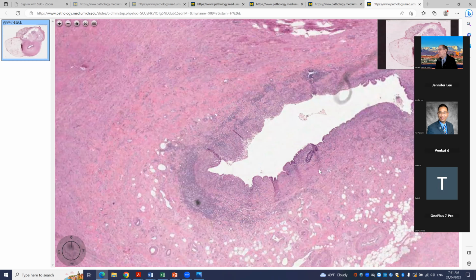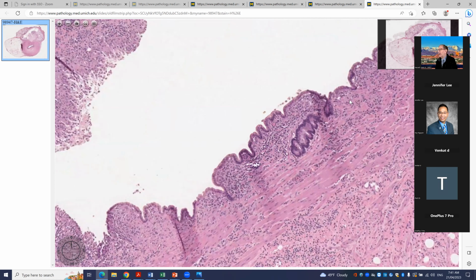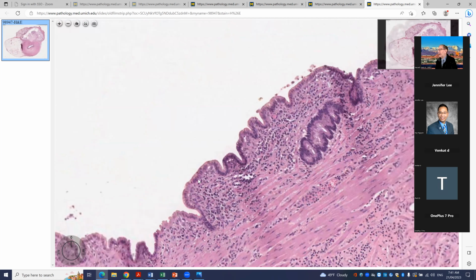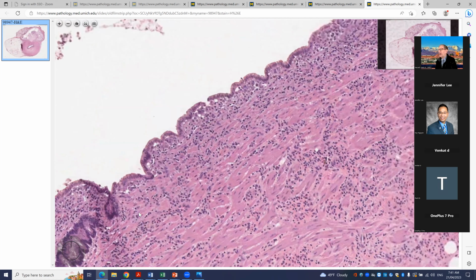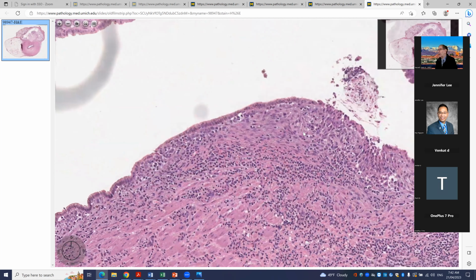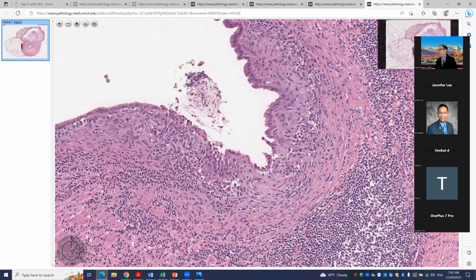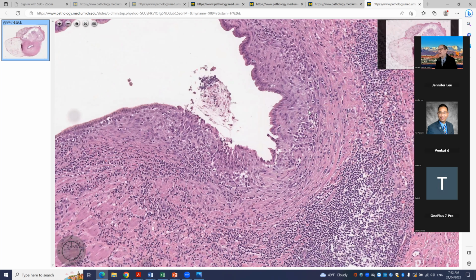Again, lost some of the lymphoid inflammation, and our epithelium is kind of blunted or changed and doesn't look particularly mucinous here. We've got a little bit of sort of granulomatous response, a little bit of luminal erosion, and so forth. So this is an altered lumen and mucosa, but it's not clearly neoplastic in this section.